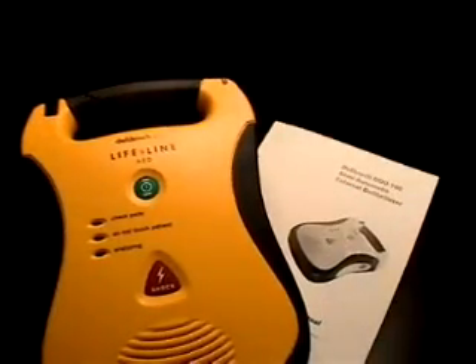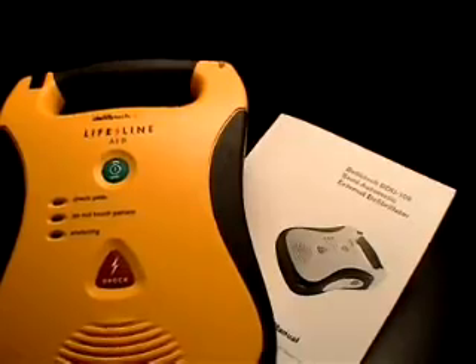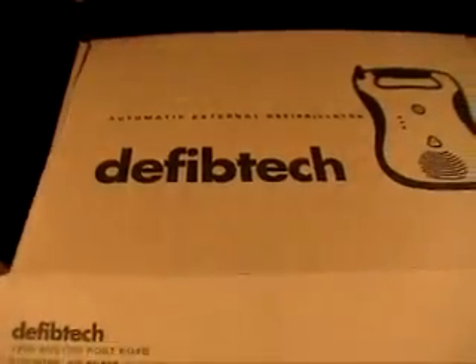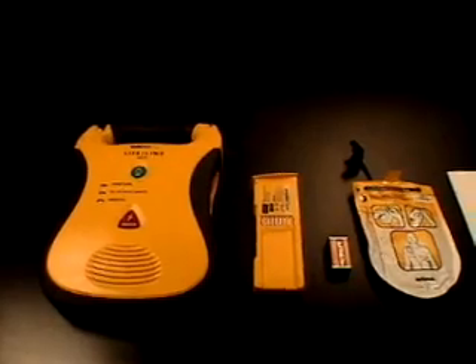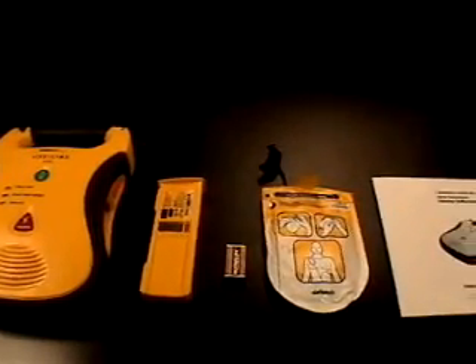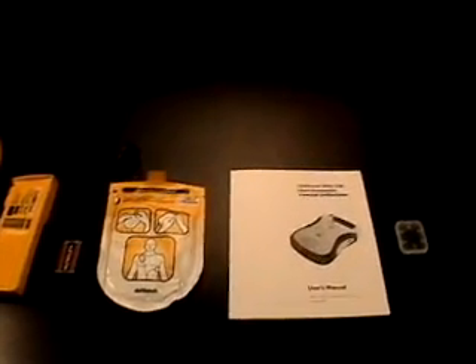For a complete discussion about the Lifeline AED, its voice prompts, and other related information, please carefully review the user's manual. The critical components of the Lifeline AED system are: the Lifeline AED, a lithium battery pack, a 9-volt battery, a pad package, a user's manual, and, optionally, a data card.